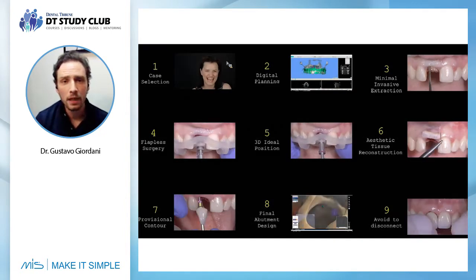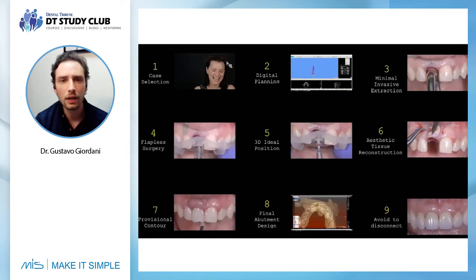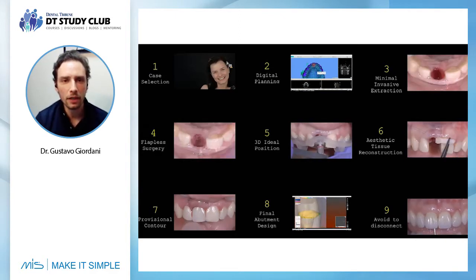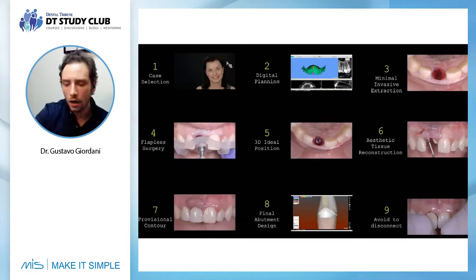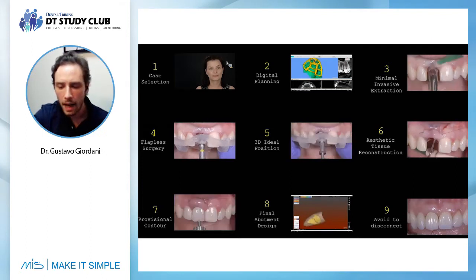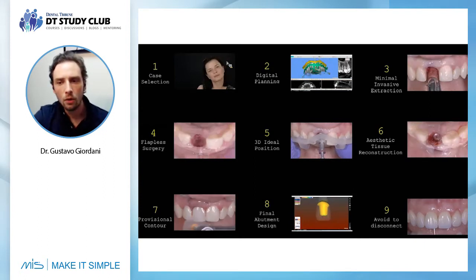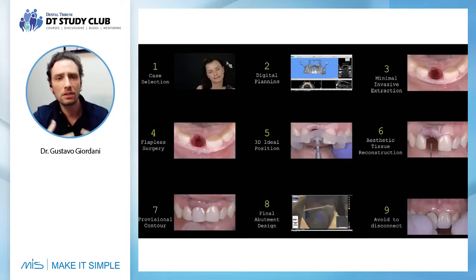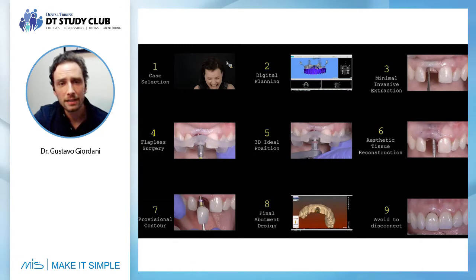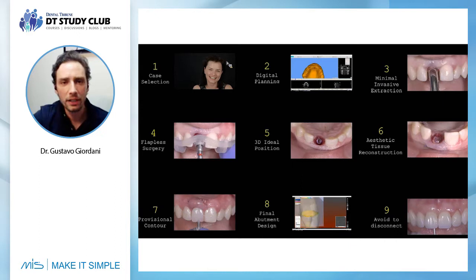This is Monica, and Monica came to Dentkof to do aesthetic rehabilitation, to have a better smile. And when this patient came to us, we started to do our digital clone. What is the digital clone? The digital clone is just taking pictures, taking videos, taking all the complementary exams to understand what we have from the patient and to try to create a treatment plan.